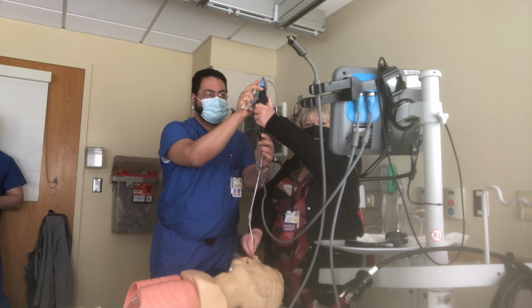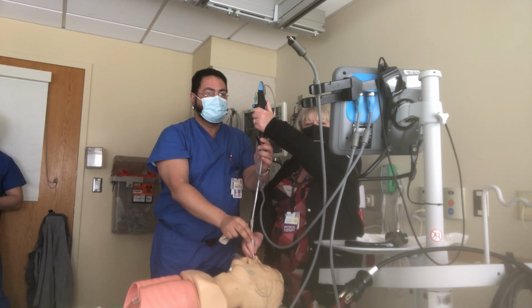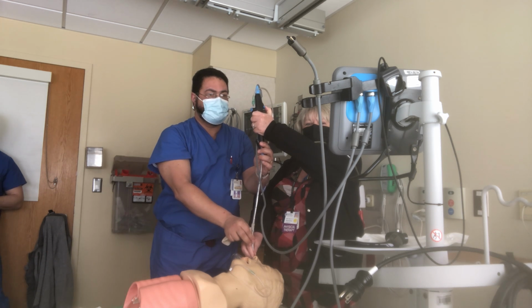More. Push it up with this finger. Up. Yeah, and then push. And then it will close. So now we gotta push it down. Push that lever up. Yeah. Yeah, perfect. And then push it up. Yeah, so push up and push.